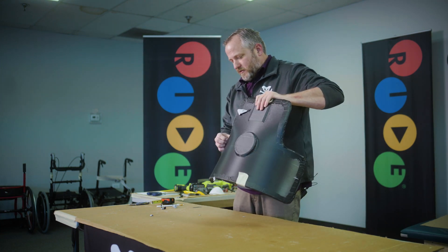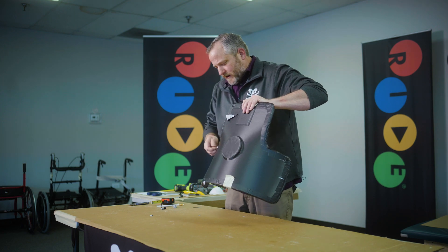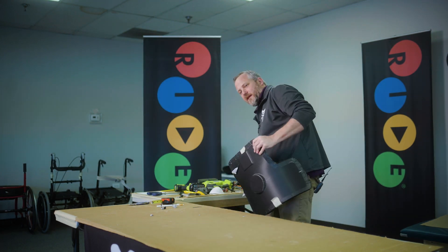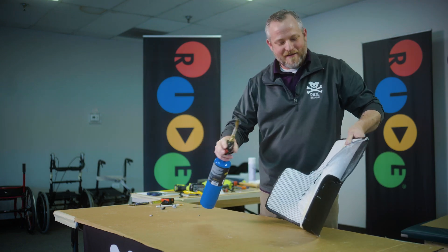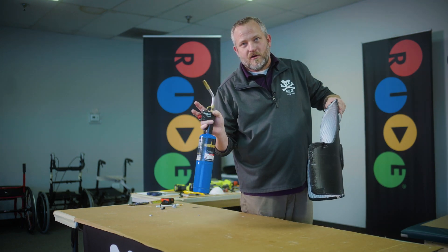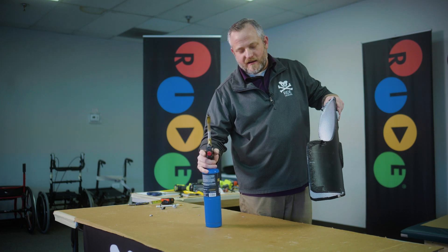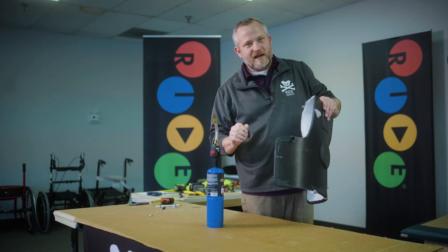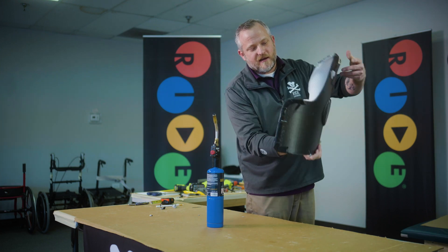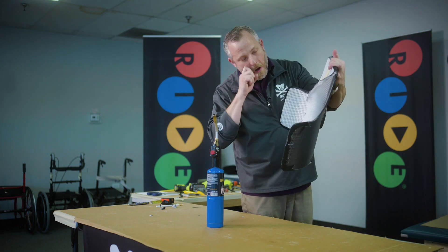If you overheat, this will turn really liquidy — that's a technical term. I'm taking my propane torch. You don't want to use map gas, just use propane. You could use a heat gun if you had three days to do it; it's going to take some time, so I encourage you to use a torch.